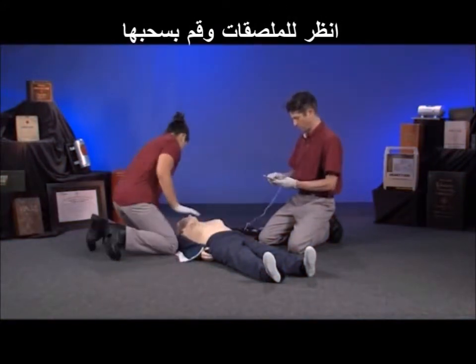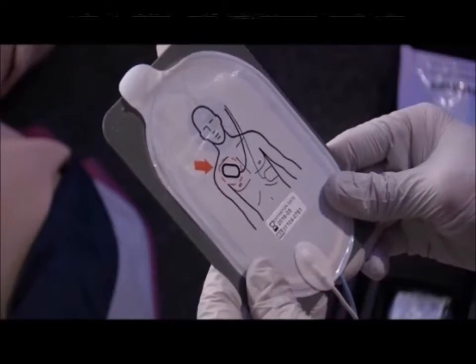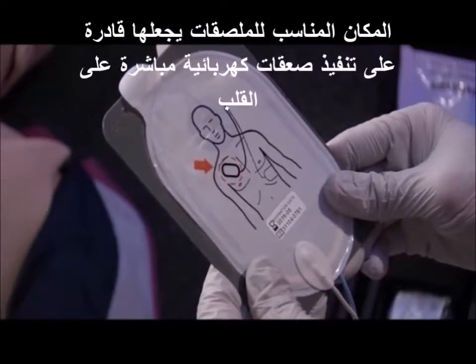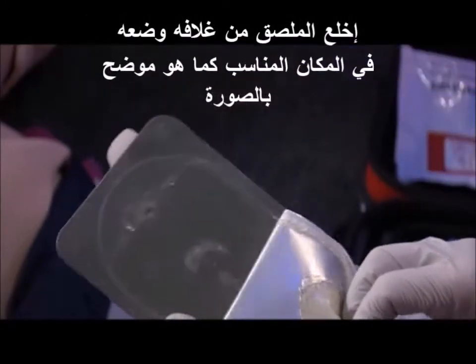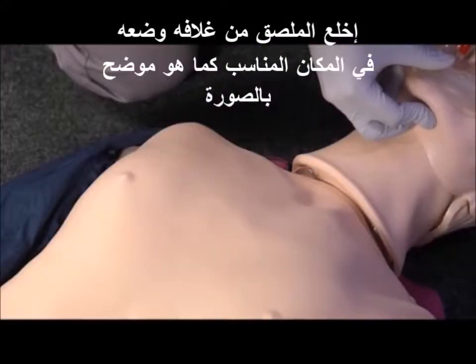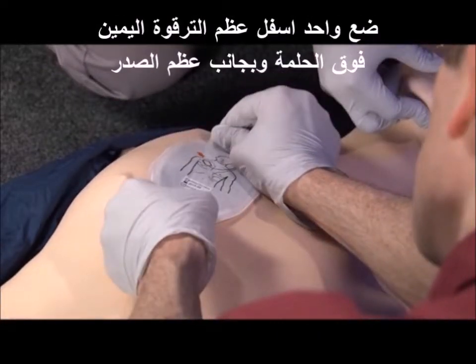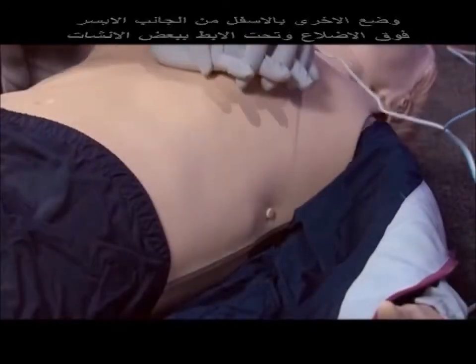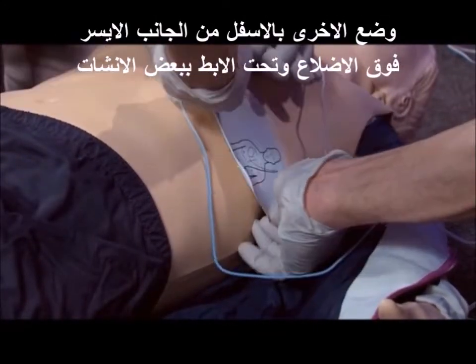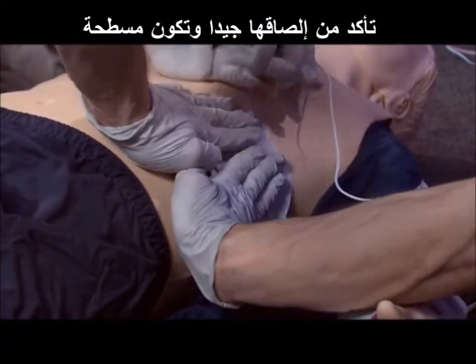Locate and pull out the defibrillation pads. The pads have pictures on them to show proper placement. Proper placement will assure that the pads are able to direct the electrical shock through the heart. Peel the pads from the backing sheet one at a time and place them as shown in the pictures. Place one pad below the right collarbone, above the nipple, and beside the breastbone. Make sure it adheres well by pressing it flat. Place the other pad lower on the left side, over the ribs, and a few inches below the armpit. Again, press firmly.